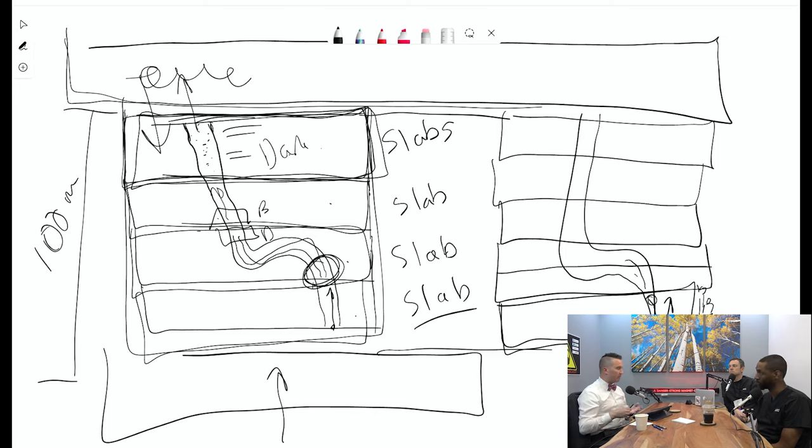Once again, the 3D time of flight takes a long time in regard to the overall coverage that you want, but it's really great for high detail and tortuous vessels. It's because we're imaging the whole volume, in three dimensions. It's literally a 3D sequence. That's why it's a 3D time of flight. You're adding up all those individual slabs to be a 3D volume.